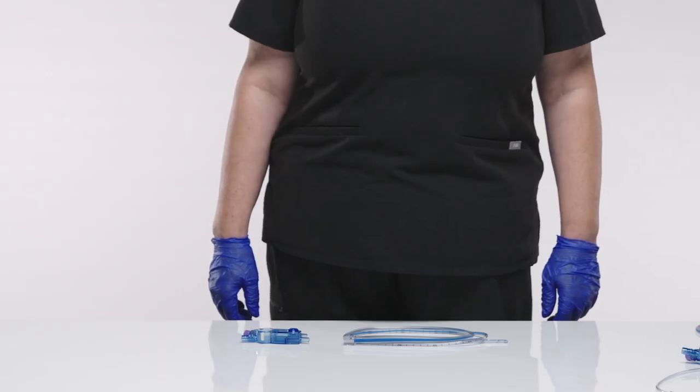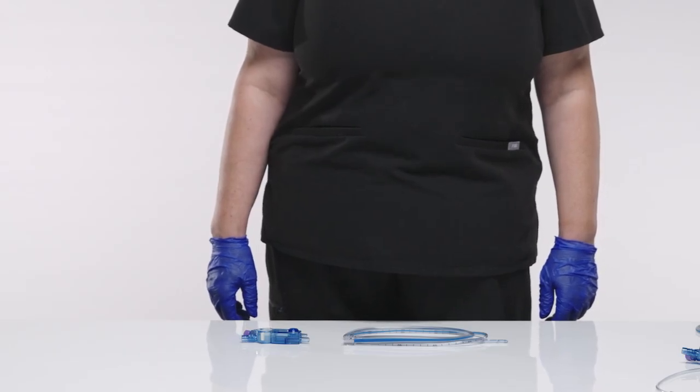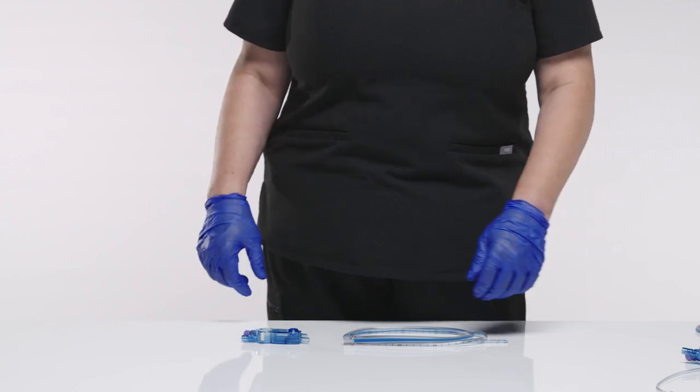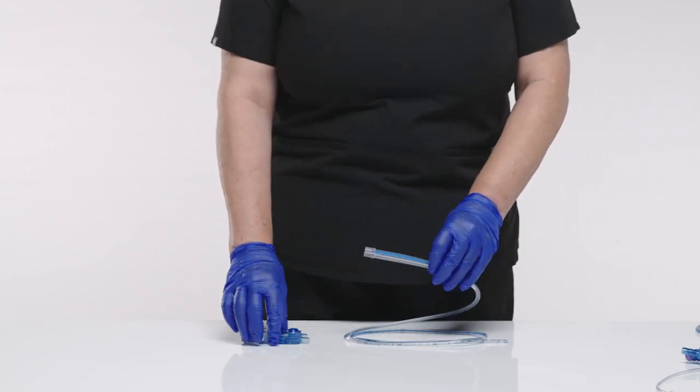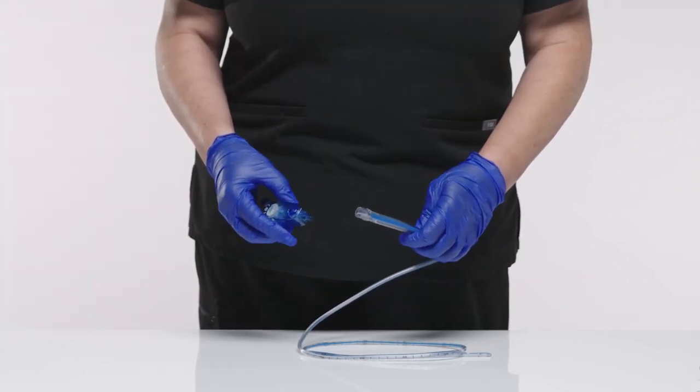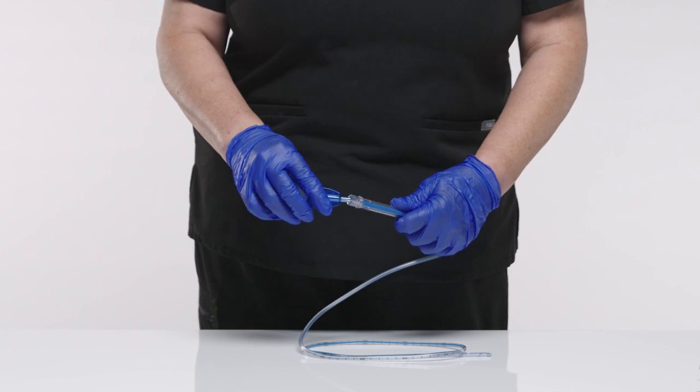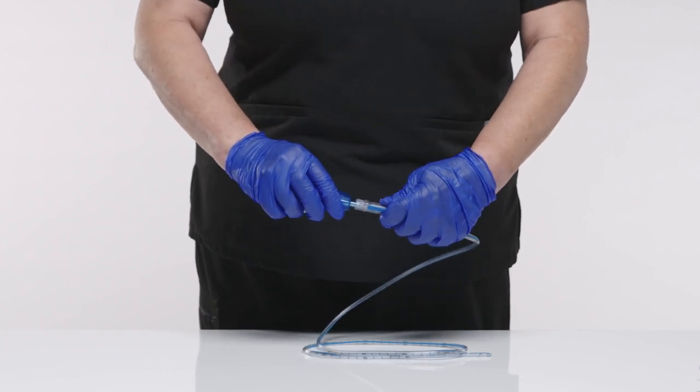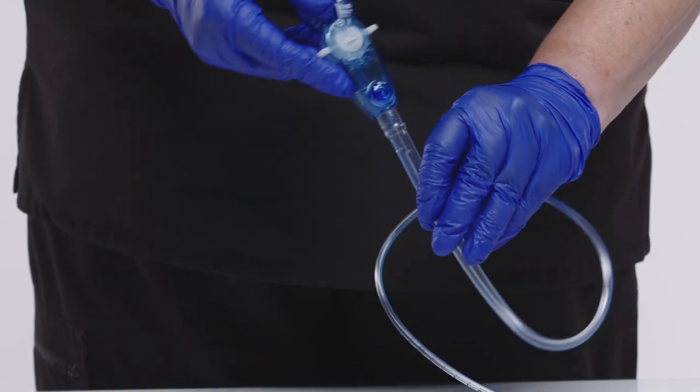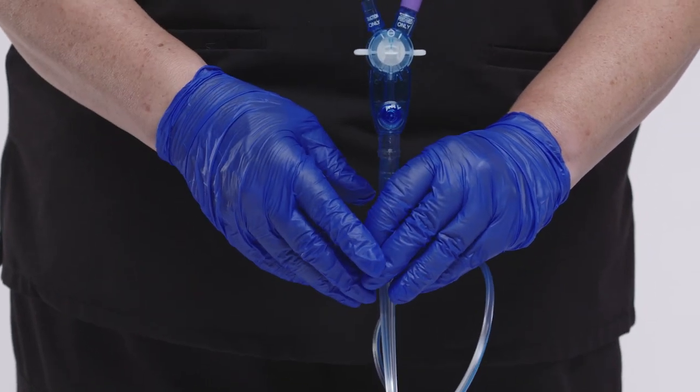The Kangaroo Salem Sump with Multifunctional Port with EnFit Connection will either come individually or with a Salem Sump. In both instances, the clinician will need to assemble the product. Insert the larger diameter post into the larger diameter hole of the suction lumen on the sump tube. The part is properly attached to the tubing when the face of the port is flush with the end of the tube.